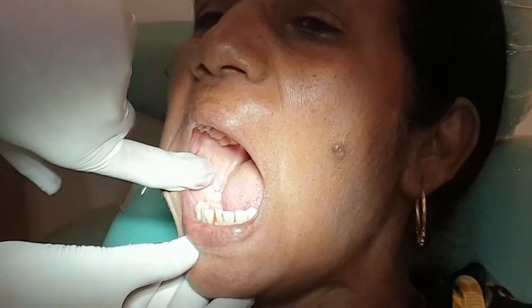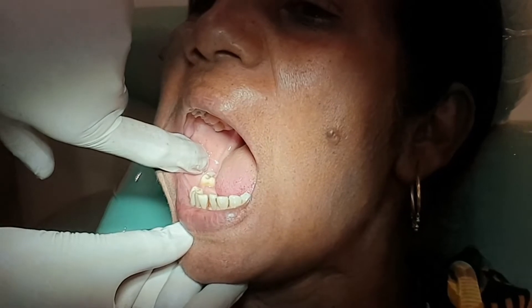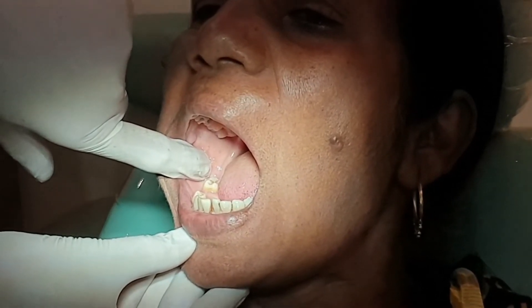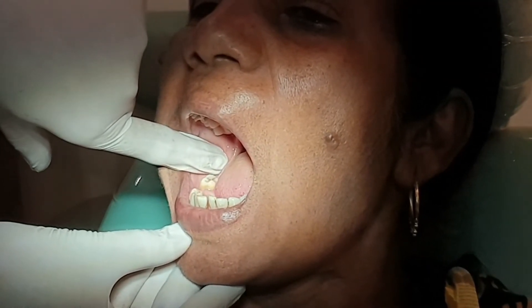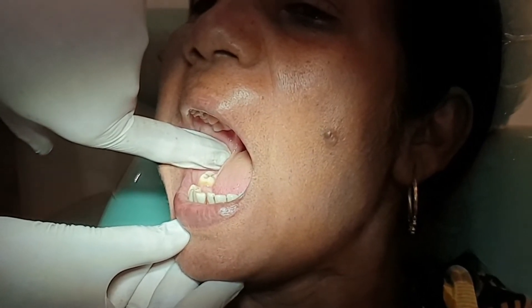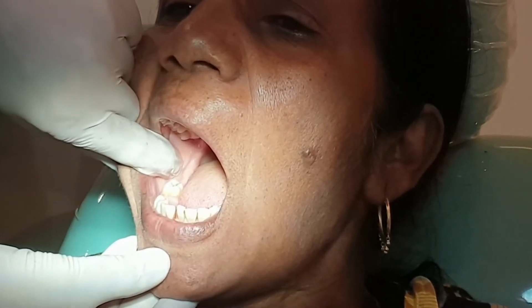Next, the finger should not be moved in an up-and-down direction — it can only be moved in a lingual or buccal direction. We proceed palpating the Retromolar Triangle, followed by palpation of the Internal Oblique Ridge. Once the Internal Oblique Ridge has been palpated, we move our finger buccally, still in contact with the Retromolar Triangle.